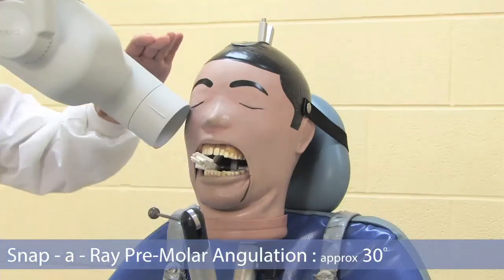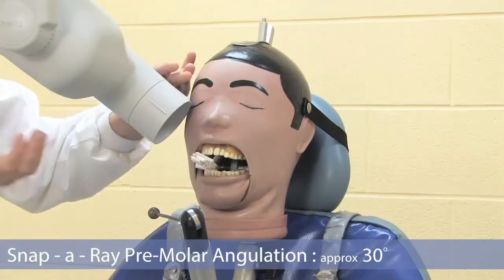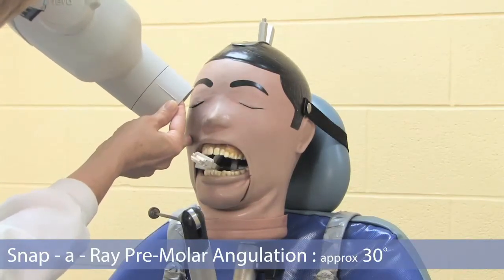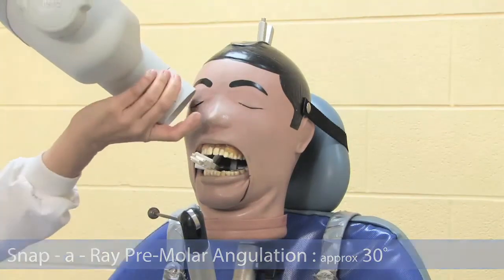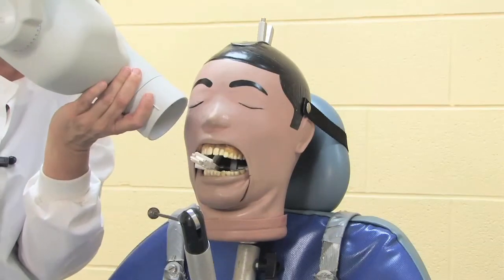What I'll look at is I'll place, first of all, I want to make sure that my PID is horizontal to the film as possible to decrease the chances of overlap. Remember that my point of entry is mostly through the pupil or the inner canthus of the eye. I'm lining up my PID. Again, I'm a little close to the eye there, but I'll keep it away a bit more.